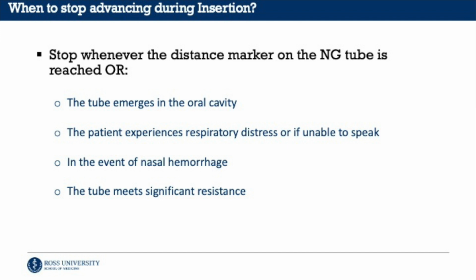Stop whenever the distance marker on the NG tube is reached, or in the following situations: if the tube emerges in the oral cavity of the patient, if the patient experiences respiratory distress or is unable to speak, in the event that the placement of the nasogastric tube causes a nasal hemorrhage, or if the tube meets significant resistance.